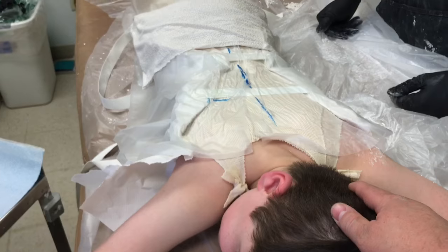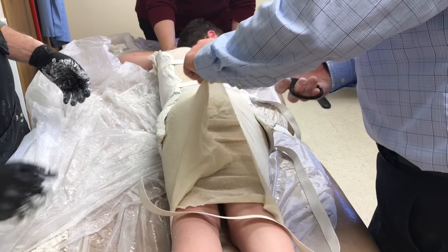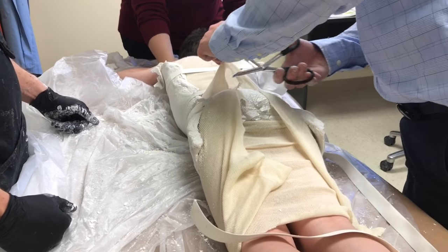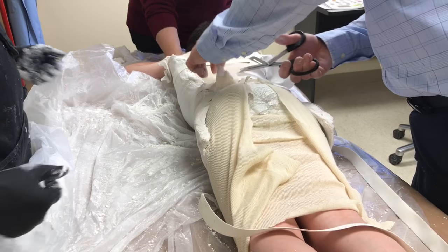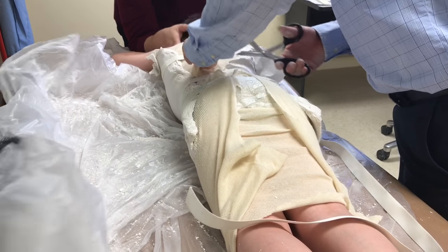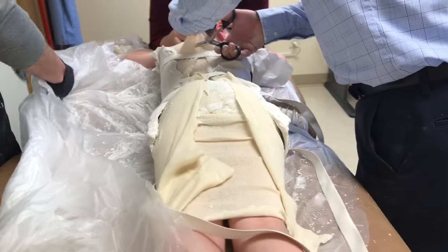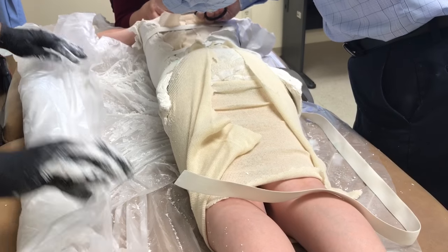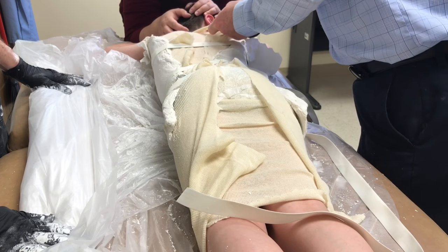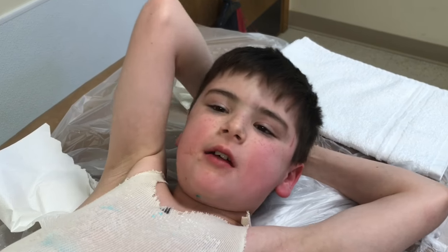Is he done with the plaster? No, he's still going to have another shirt on. This outer shirt's a little bit stuck to the front so we'll take that off. Those naughty scissors — they're safe, they're very safe. Nice and simple. Everything's all done and I'm doing great.